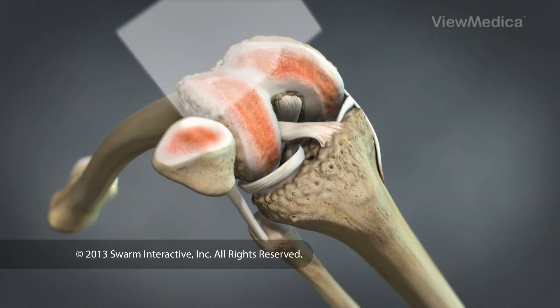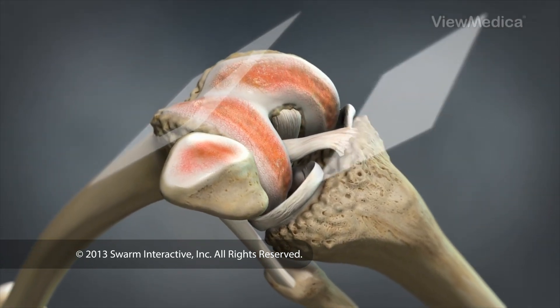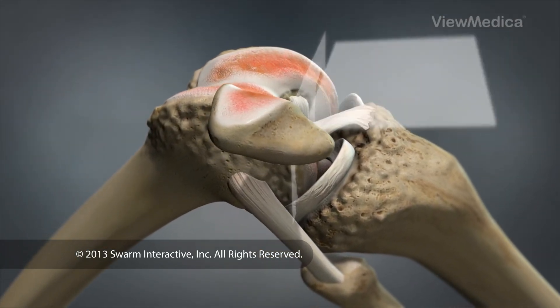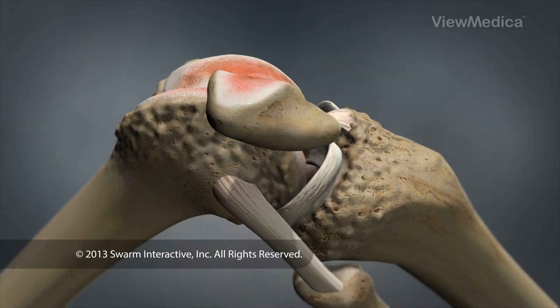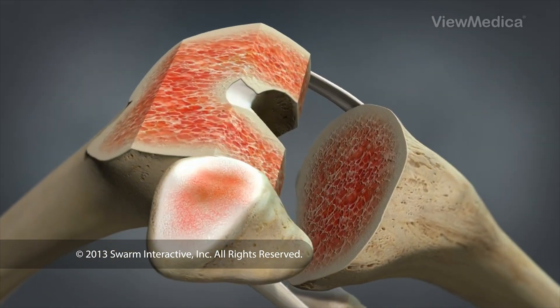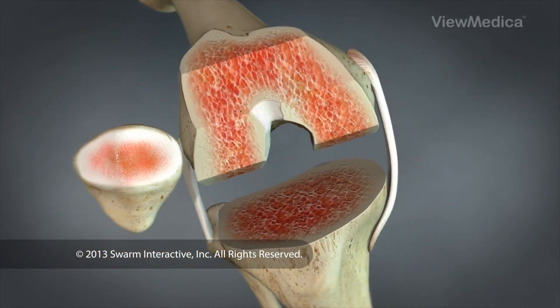The surgeon carefully trims away the damaged ends of the femur and the tibia, removing cartilage and a small amount of underlying bone, reshaping the bones to provide a stable platform for the artificial components.